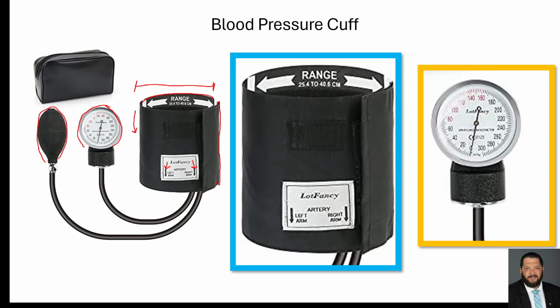As you can see on the screen here, it's a gauge. It's an analog gauge denoted in pressure. This is noted in millimeters of mercury. And you can see that you've got 20, 40, 60, 80, all the way up to 300 on this one. And then each small line in between indicates 2 additional millimeters of mercury. So for example, one line past the 40 would be 42 millimeters of mercury.